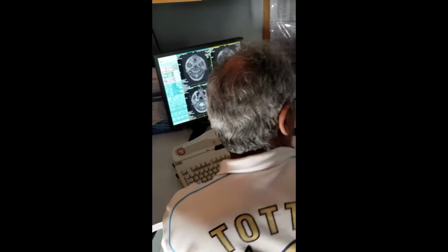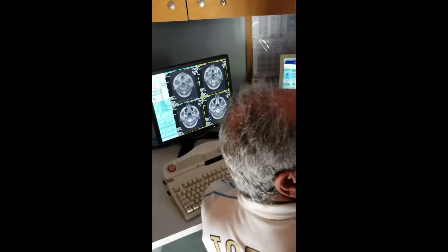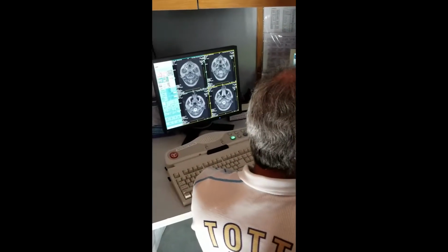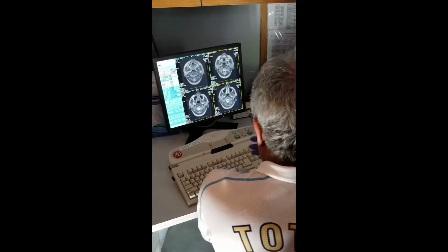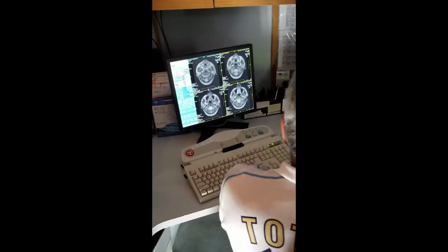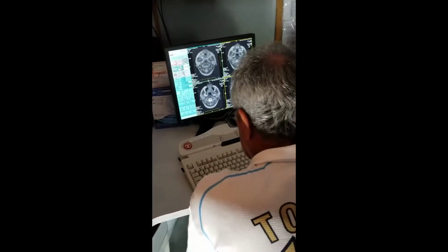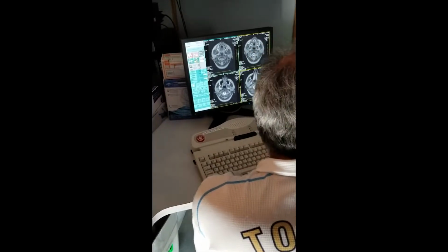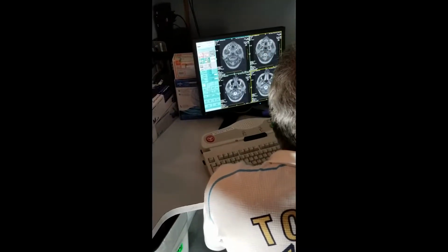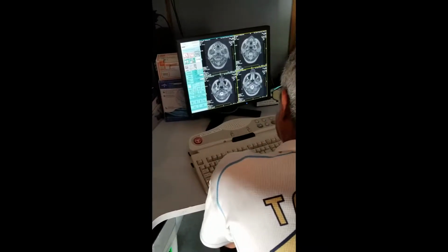Search browser. Okay. Now if you're only doing 2 or 3, you can go back and forth. But in real life, you're going to do 12 sequences or 10 sequences. Are you going to click next, next, next, next? So you just come and say S for series and whatever number you want. I know axial was number 3, so I said S3.